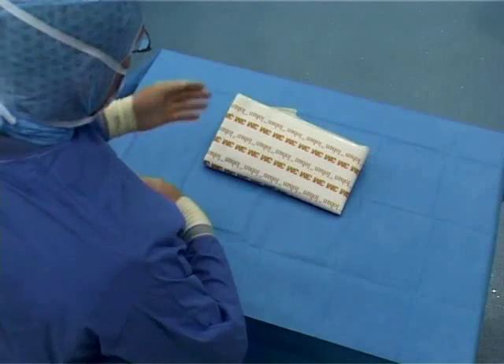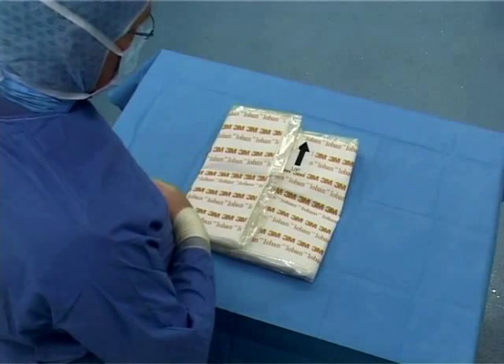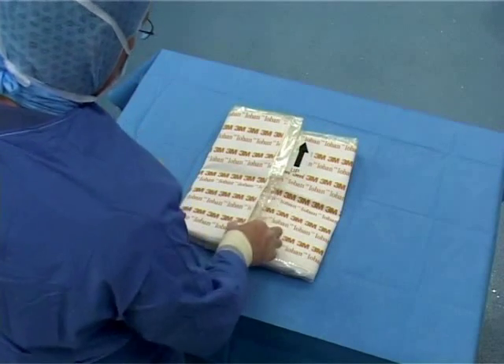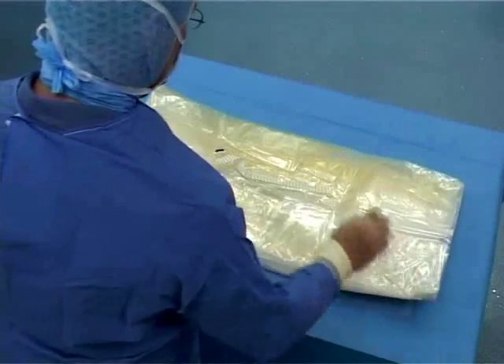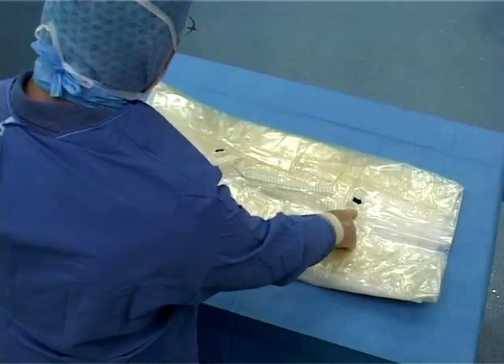The 6619 Vertical Isolation Drape with ioban in size is an impervious clear plastic drape. It features an arrow pointing to the top of the drape indicating the correct position. When open to the sides, further printed arrows indicate the top corners of the drape.